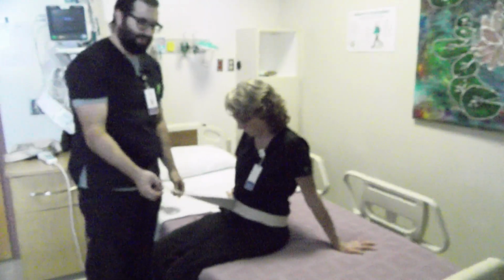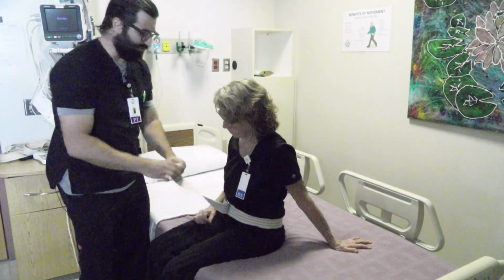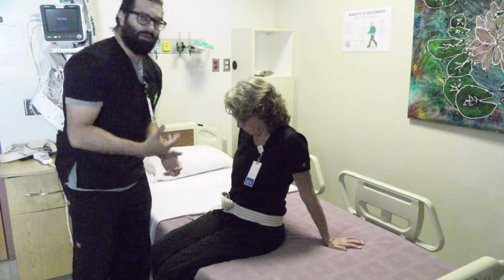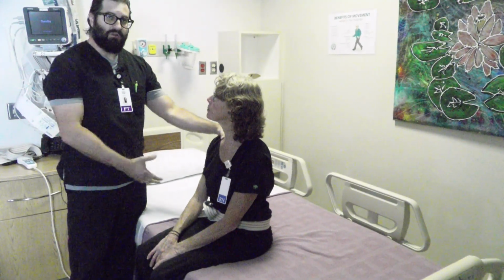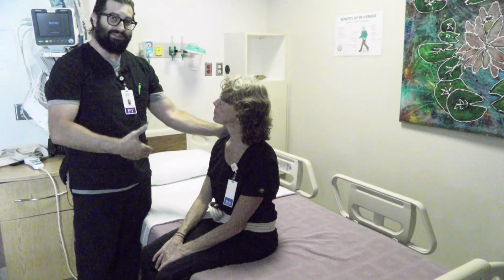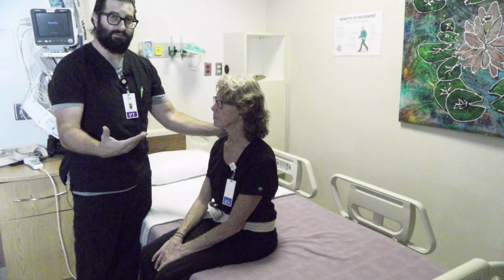Okay. Now you see I've got a couple feet left. What you can do with that for safety purposes is you can stick it through the back of the belt like that, so you don't have a bunch extra hanging down, okay? So now I've got my patient, Miss Patty, here on the edge of the bed. I've put the gait belt on properly, and we're just going to demonstrate a sit to stand, and I'm going to show you the technique that is best used for that, okay?